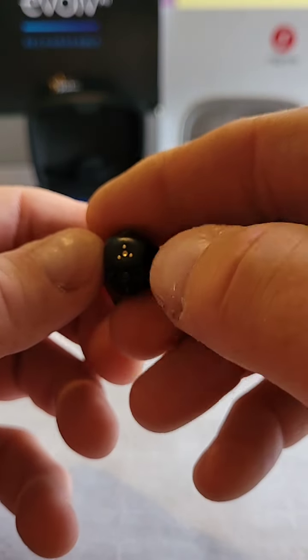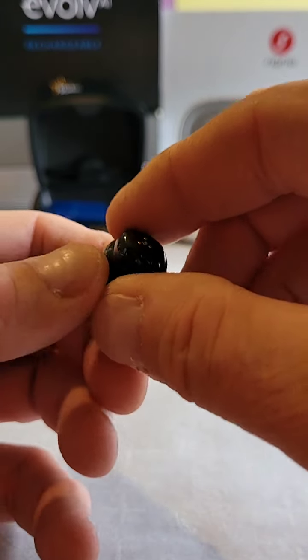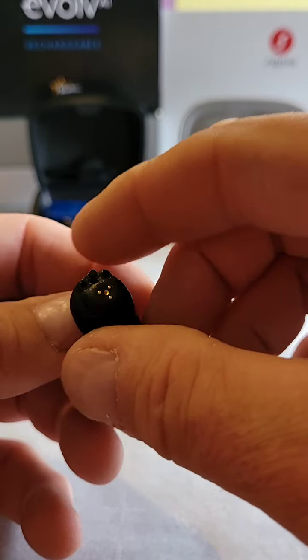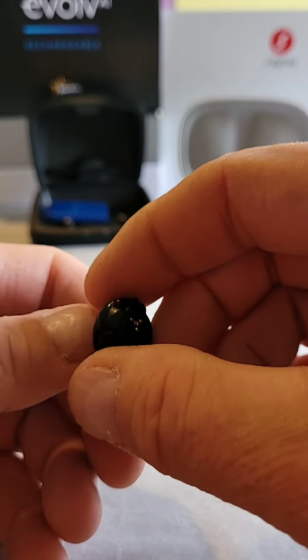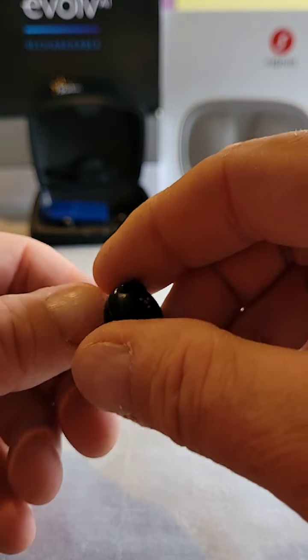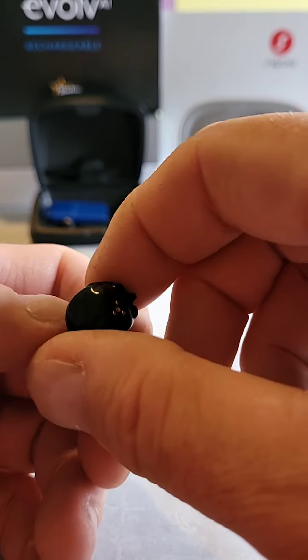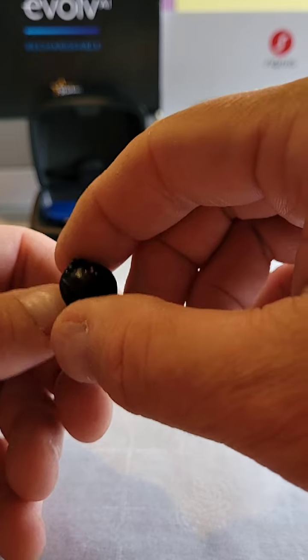And they do have the copper contacts exposed. From what I read, that's just another avenue for moisture to access your hearables, and moisture, as with any electronics, is the biggest enemy. But both manufacturers state that if you drop these in water or jump in the shower with these, you just need to take them out as quickly as possible and dry them off, and you should be okay. That being said, I also recommend putting a little bag of desiccant in your hearing aid charger, just to help draw out any moisture throughout the night or day when you're having these things charged.